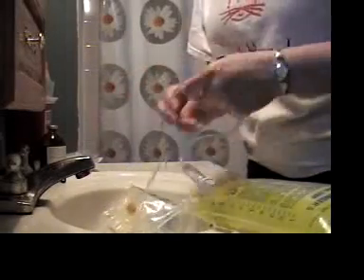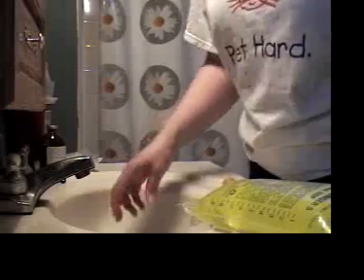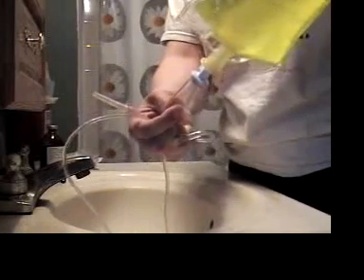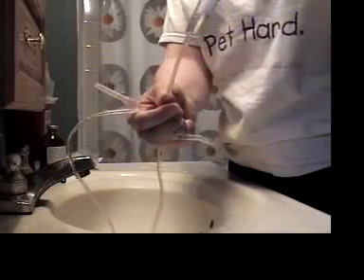Now, usually you'll land up with some air in the line. I like to get as much of the air out of the line as I can. Not the end of the world if there's a little air in here, but it can be uncomfortable. So I start by squeezing a little bit on this little port here so that I get some fluid in it.